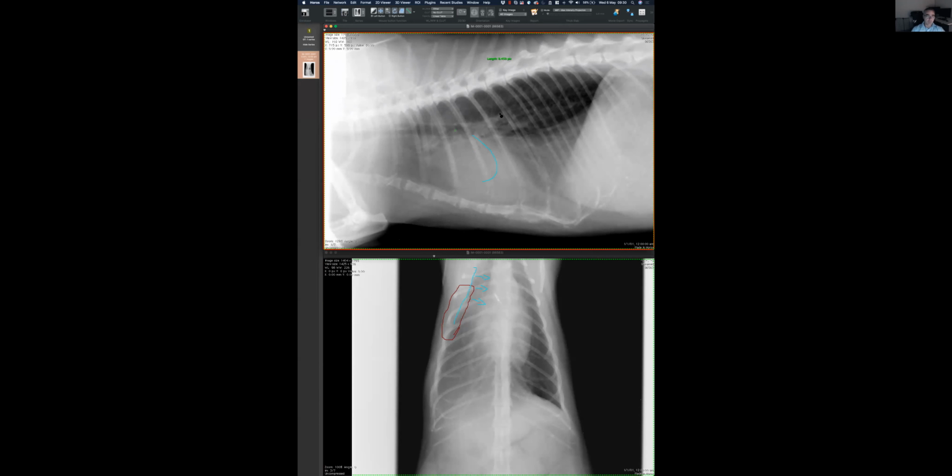Makes sense? Because anytime we think about pleural disease to start explaining this finding, then we hit the wall when we see that. Because that is completely unexpected in pleural disease. If there is enough pleural effusion to create this overall increase in opacity, then we would expect that contour of the heart to be gone because of the heart being surrounded by fluid. Same exact principle. Any other hypotheses?